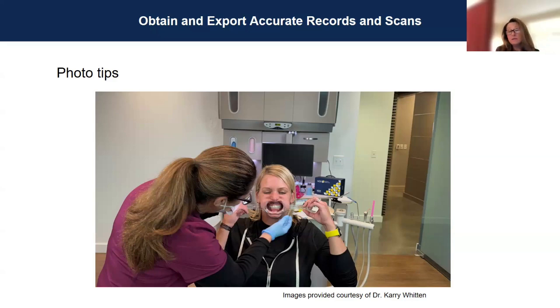So yeah, buccal mirrors work wonderfully if you didn't want to have a retractor like this. And you can get these retractors too from your dental supply company. They even come in black now. Amazon has packets of those too, and I don't know what their brand name is. I just always look up dental photo retractors. Any questions about any of that?